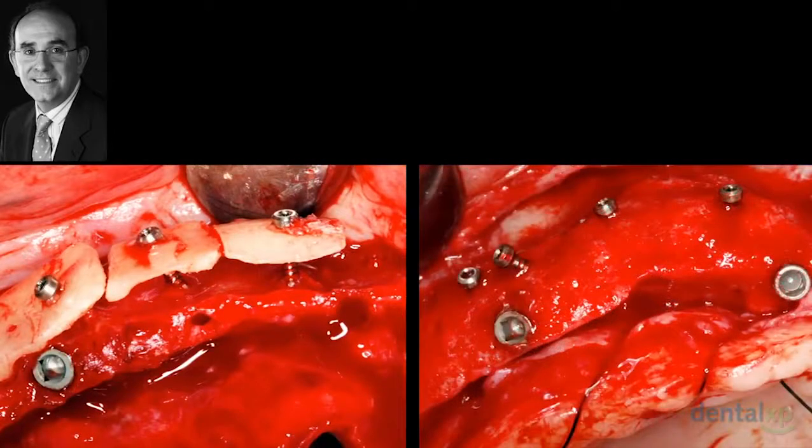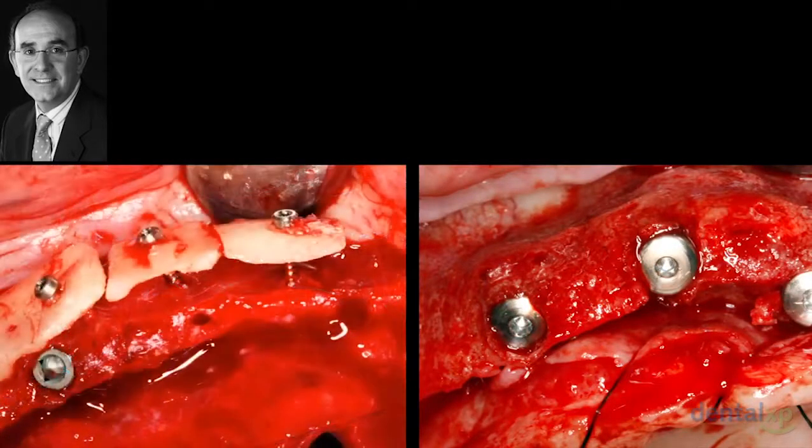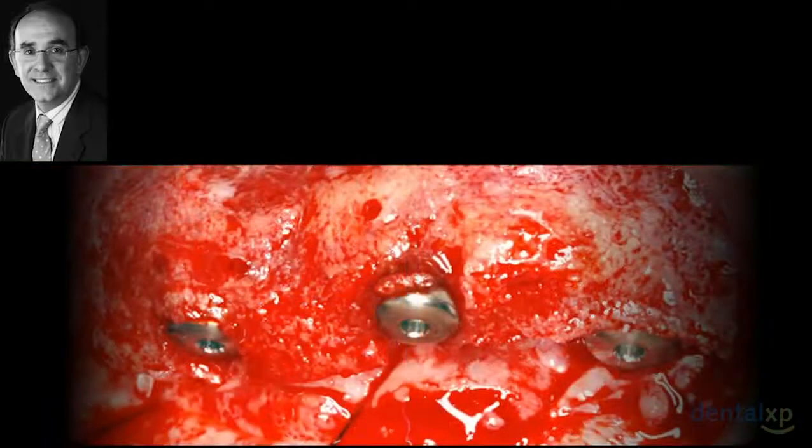The advantage is that if you place transitional implants, you can do immediate loading after that. This was the position of the implant, and this was the volume that we obtained with this protocol, in which in 100% of the cases, I use autologous proteins, and I use only autologous membrane. It's possible to use the GBR technique, of course.